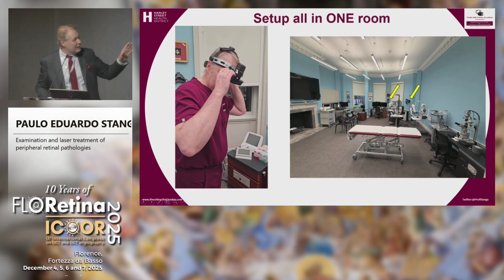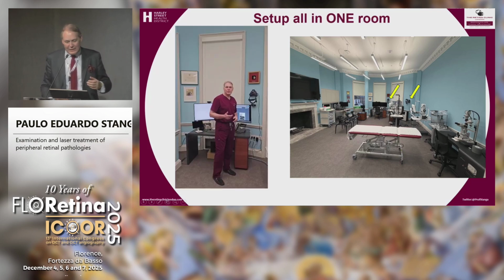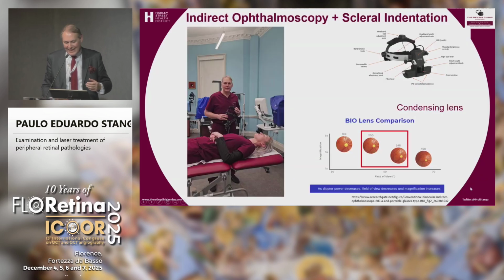But it's important that the indirect, this is fixed, there's a cradle fixed on the wall, and I just rest it there and the indirect charges. It's important that it is at a comfortable distance, so you can use it.